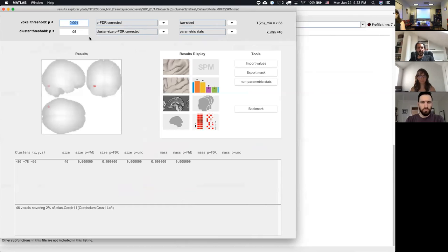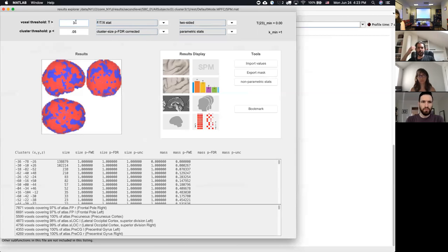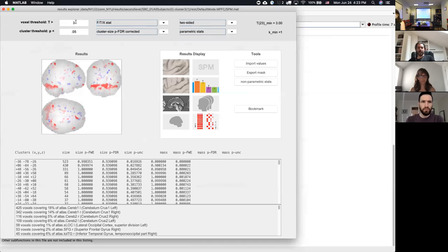So because of that, it doesn't matter which criteria you use for this high threshold. It could be an uncorrected value. It could be an actual statistical value. You can say all of the T statistics above 3. It doesn't have to be an actual p-value, and it doesn't have to be corrected. It's some arbitrary or somehow arbitrary high threshold that you determine, the cluster forming threshold, that is going to be used to determine what you call a cluster.